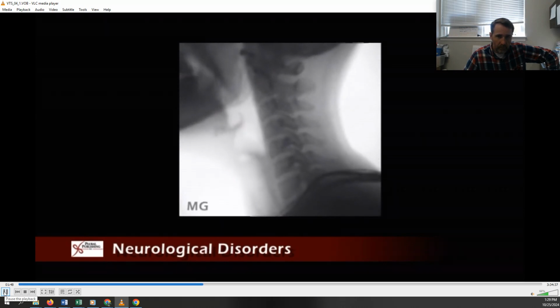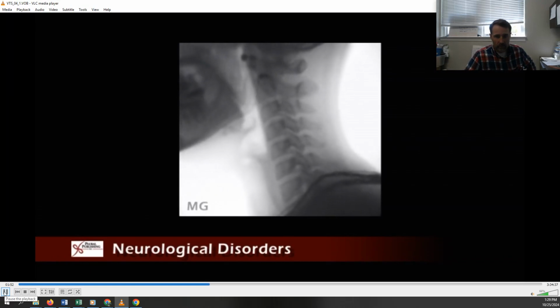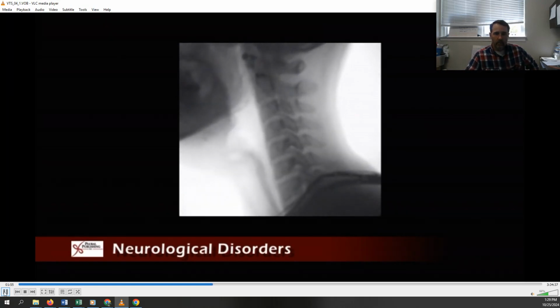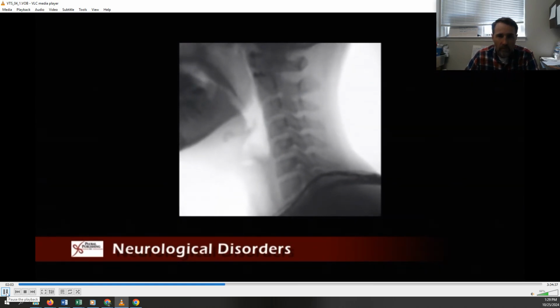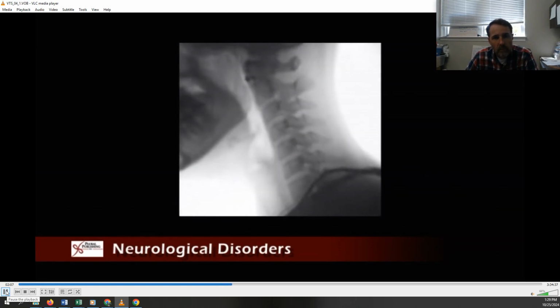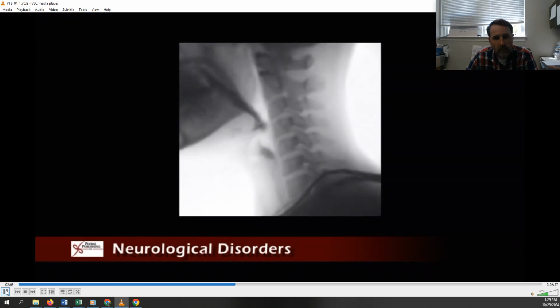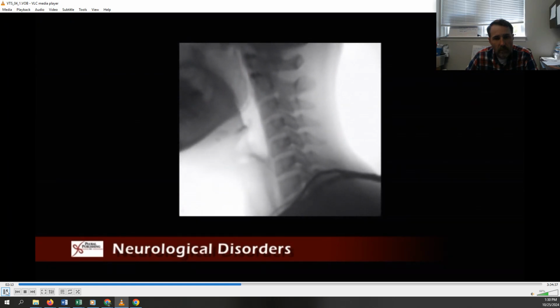This 35-year-old woman has a 5-year history of the degenerative condition myasthenia gravis. She presents with moderate flaccid dysarthria and mild swallowing difficulties, which are more pronounced once fatigued towards the end of meals. She compensates by eating small amounts often, avoiding chewy solid foods, and by taking medication half an hour before meals to optimize swallowing. Note the following.